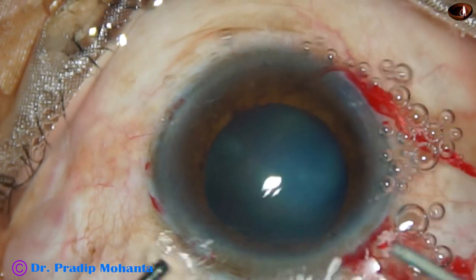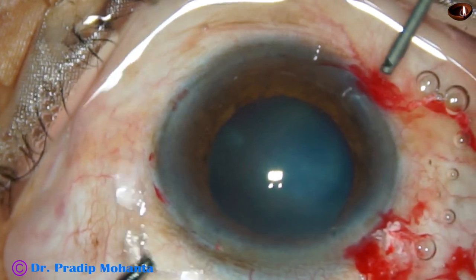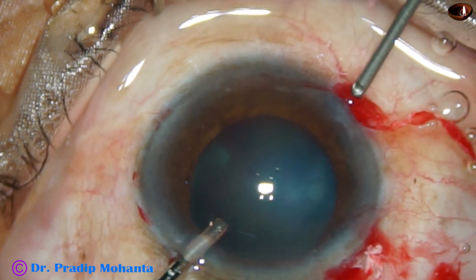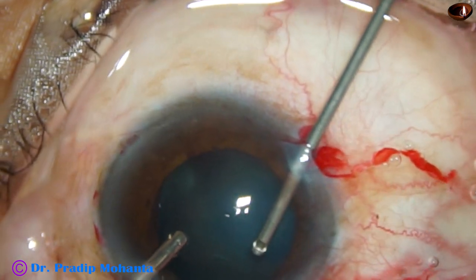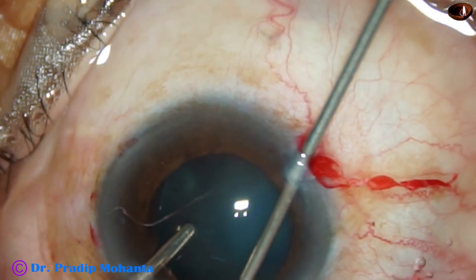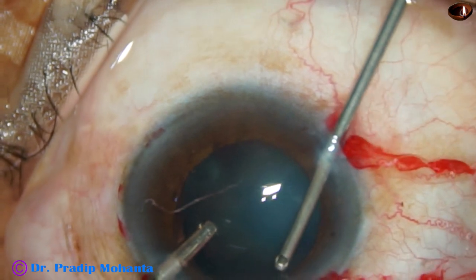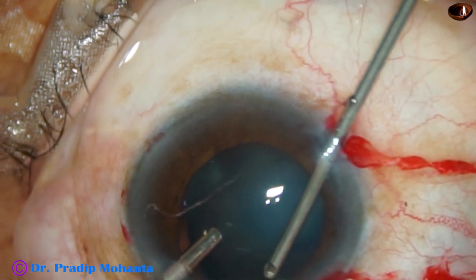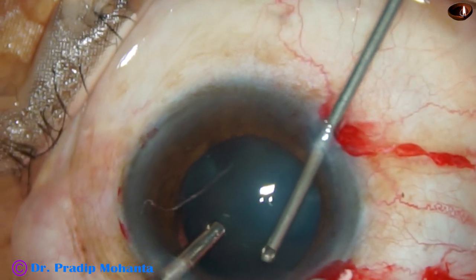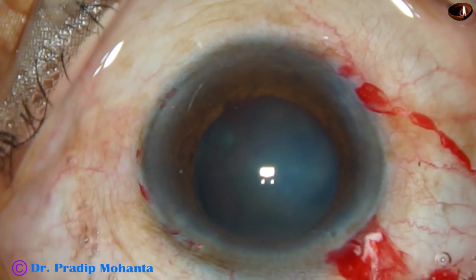This is cutting the prolapsed vitreous. I go through the side port at 11 o'clock and cut the vitreous strands just adjacent to the main incision. And thus the anterior chamber is made free of vitreous before doing capsulorhexis.